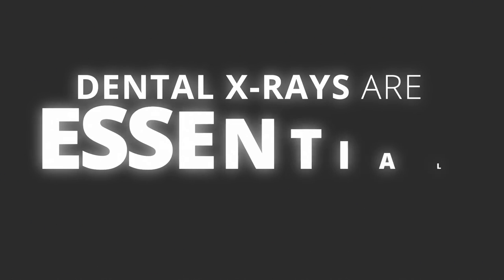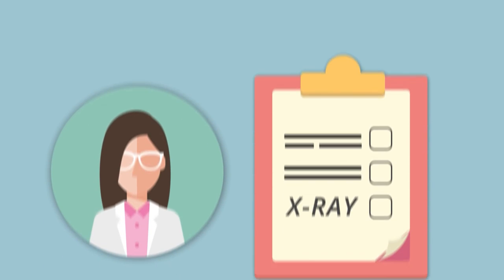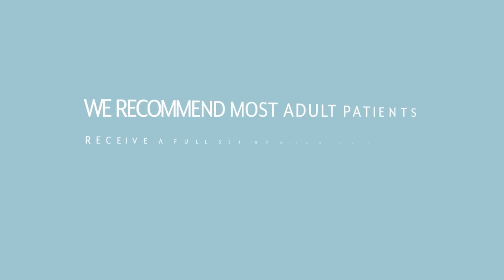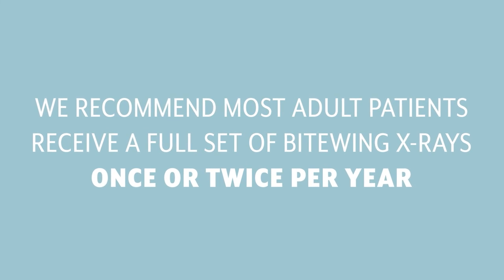Dental x-rays are essential to good oral health. In fact, many state dental boards require dentists to use x-rays as part of their standard of care. We recommend most adult patients receive a full set of bite wing x-rays once or twice per year.